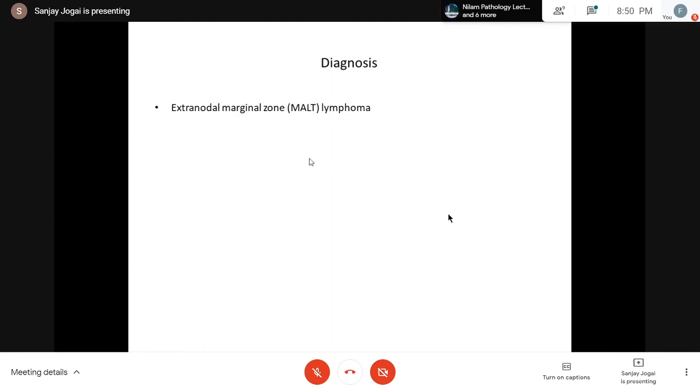Now when it comes to pulmonary lymphomas, most of the time, common things being common, in core biopsies we see lots of diffuse large B-cell lymphomas. In excision specimens, we tend to see marginal zone lymphomas. Less commonly, you will see lymphomatoid granulomatosis, which I showed you previously. But Hodgkin lymphoma in the lung as such is very uncommon. Within the mediastinum, we see a lot. I'll do the mediastinal entities another time, so I'll restrict it now.